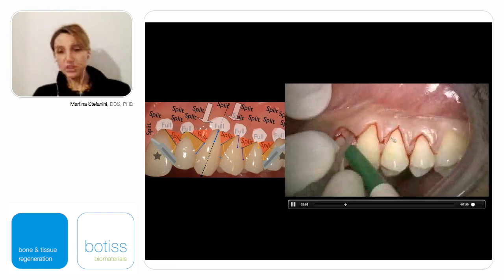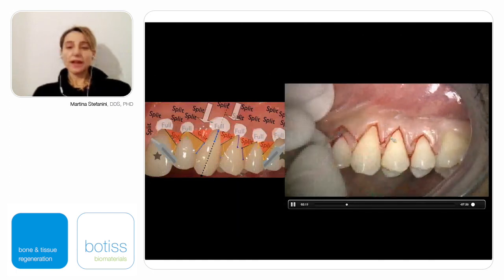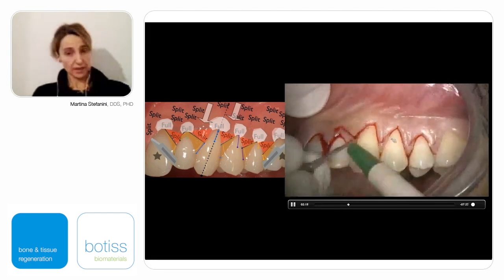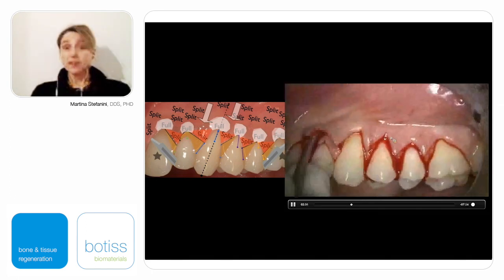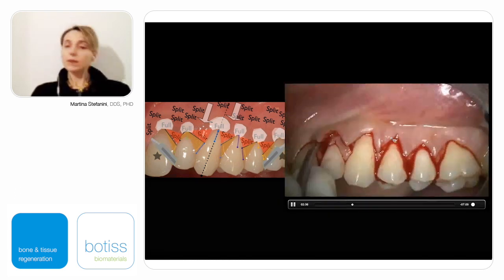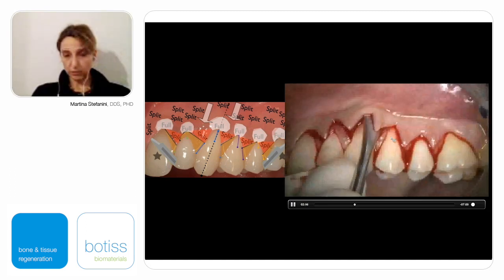This is the imaginary line that connects the sulcus of the adjacent teeth, and this is exactly the level where we should stop our split thickness of the triangular shape papilla, trying to keep intact the delicate vertex of this triangular papilla and maintain as much as possible a uniform thickness in the entire body of the papilla, maintaining the blade parallel to the bone.